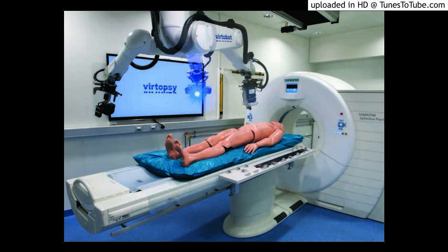It describes the entry point of the foreign object, bullet tract, and exit pattern of wounds, pattern of bony fracture, and soft tissue damage. Postmortem CT enables the measurement of the radiopacity of foreign bodies precisely. Postmortem MRI can be used to diagnose soft tissue injury, contusions, hematoma, and neurological as well as non-neurological trauma. MRI spectroscopy is a new technique that is helpful in detecting changes in metabolic activities in order to determine the death timing and is also helpful in detecting death due to electric shock.